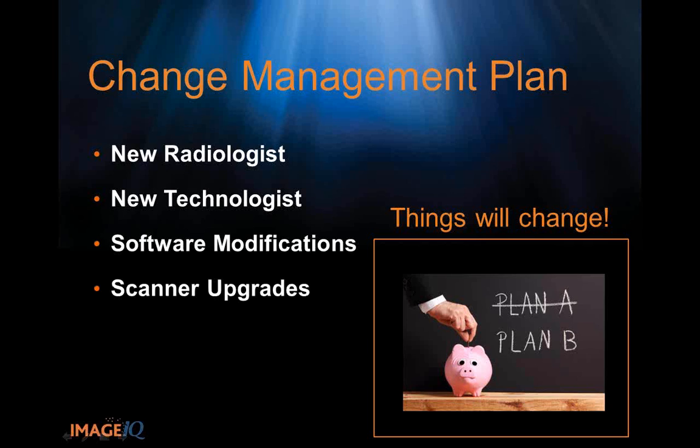Well, what happens with the next one? Now we've got software modifications. Somebody flips a hot fix on you, or it is a long trial, and gosh, what if you do a scanner upgrade? What if that's a forklift upgrade? What if it's material? Now you need to think about when you would bring in a physicist. When would you redo just a phantom scan? When would you do all of these different metrics to really quantify what has changed and that it's still within tolerances, right?